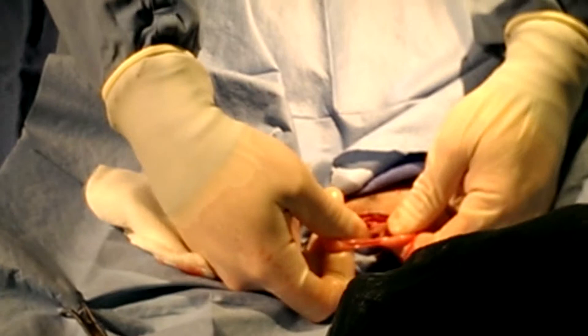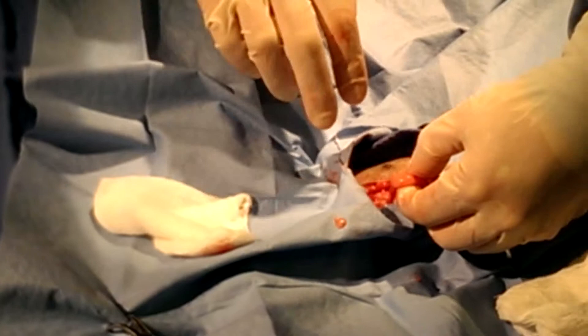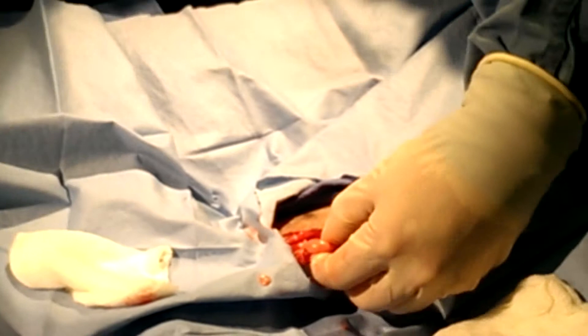What we're concerned about with this whole surgery are all these blood vessels right here — these are the ovarian arteries and veins, and what we don't want to cut. This is called the broad ligament of the ovary or the meso-ovarium. We just cut right through with our fingers. I'm keeping just enough traction to expose these veins and get the fat out of the way. Two straight hemostats, one at a time.